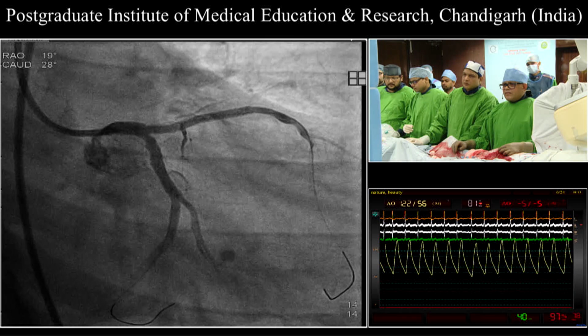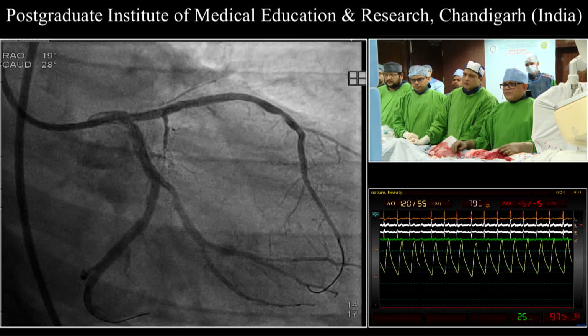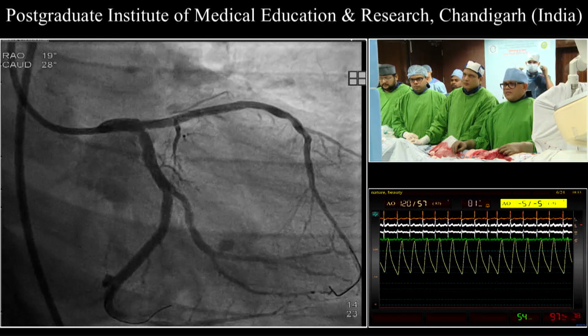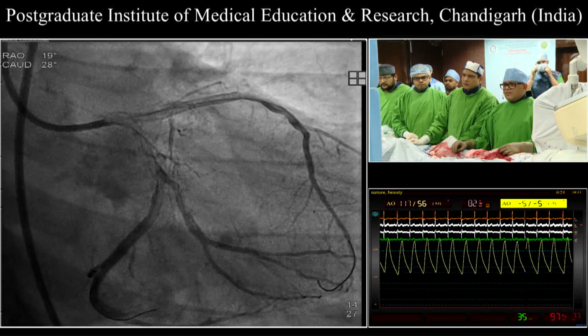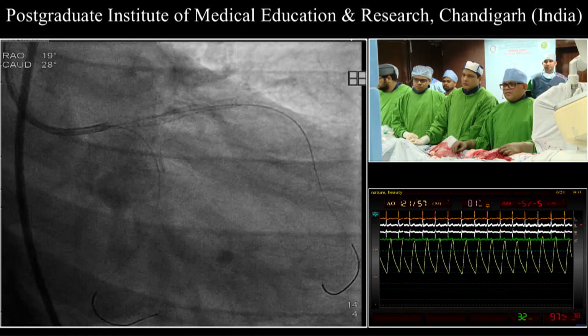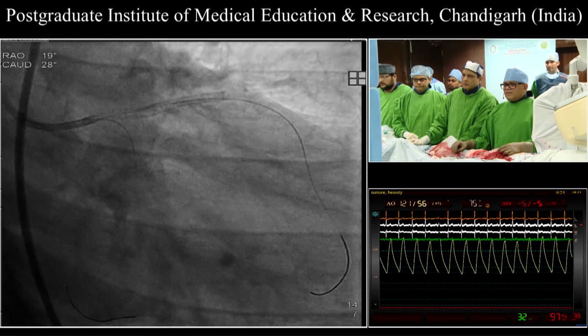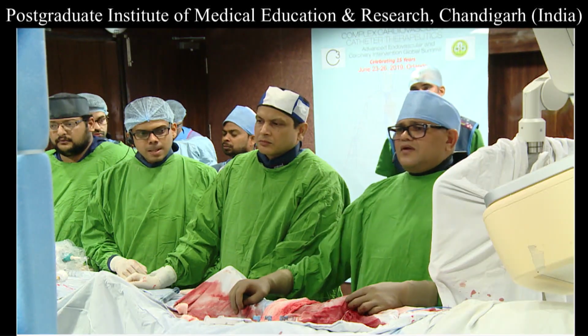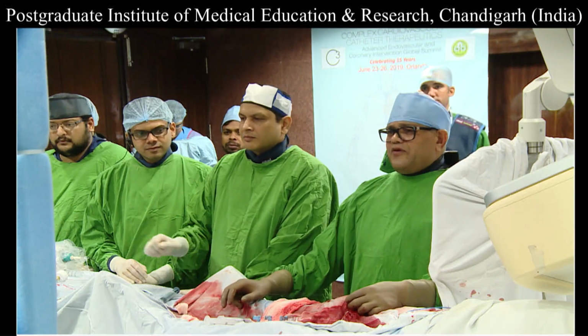But this was a really great demonstration of the ISR treatment that you offer for the LAD. And we are just 1 minute from the end of the treatment. Are there some questions or comments? If not, we would like to really thank you for the excellent demonstration, and thank you very much for supporting this treatment. Thank you very much.